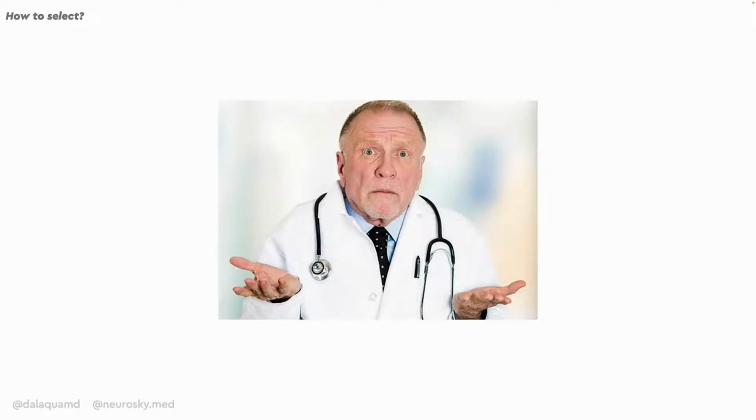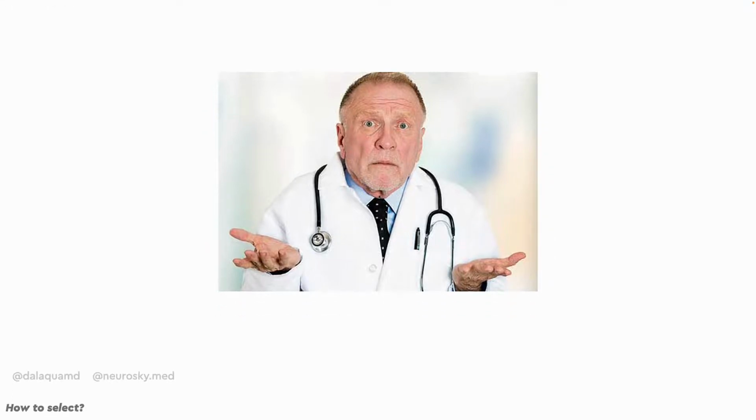And based on all that, what should we do? How should we select patients for mechanical thrombectomy in the late window?